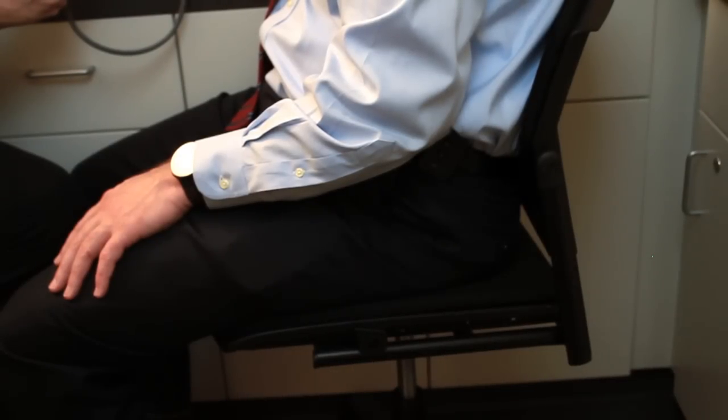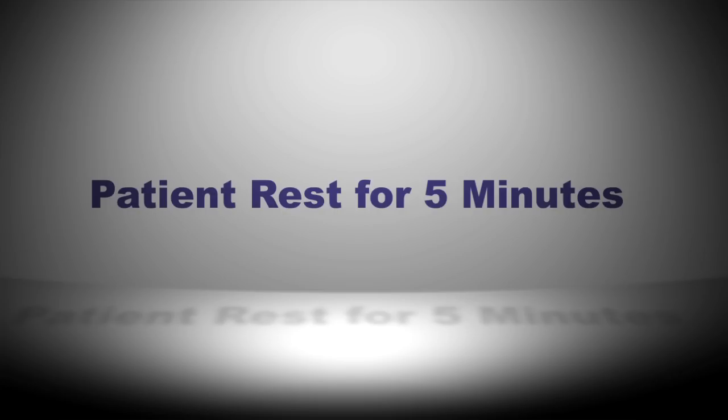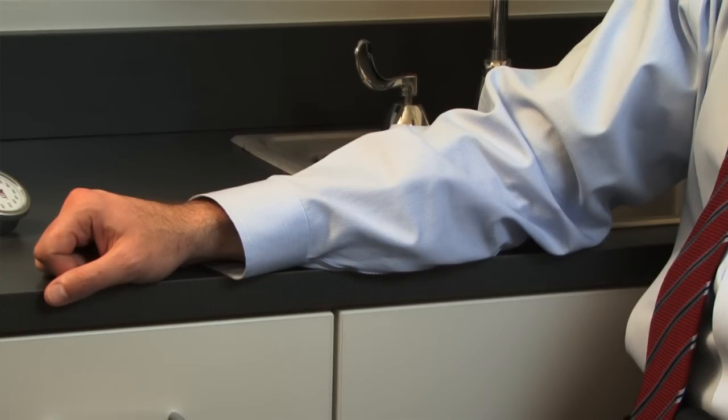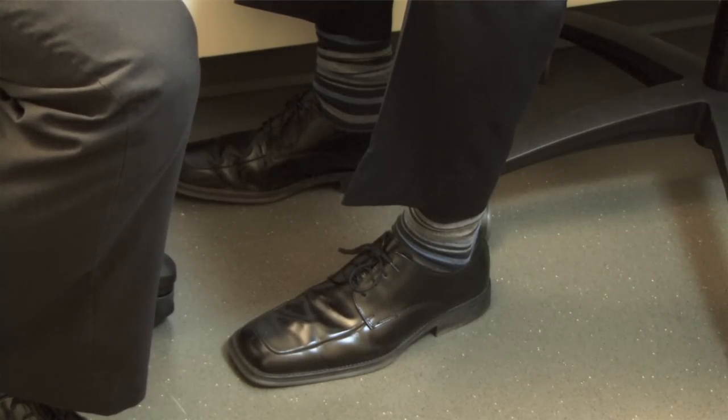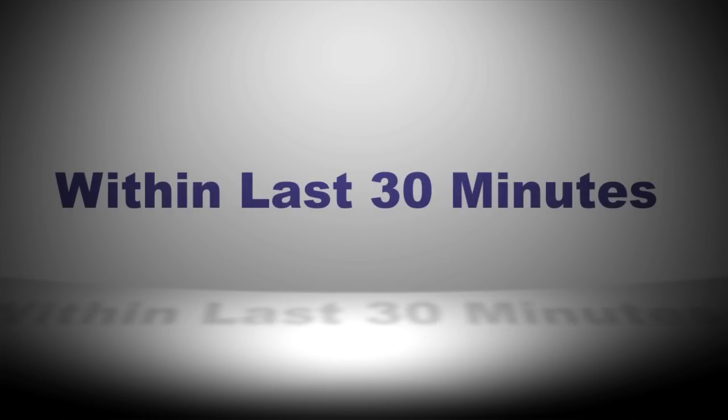A very important step is to make sure that your patient is relaxed and has had an appropriate period of rest before measurement. You want to reassure them that measuring blood pressure will not cause any pain and should be relatively quick and easy. The ideal rest period is five minutes in the position you'll be measuring — back supported and feet firmly on the ground. Also make sure the patient hasn't ingested caffeine or smoked, ideally within the past thirty minutes, but at least within the past five.